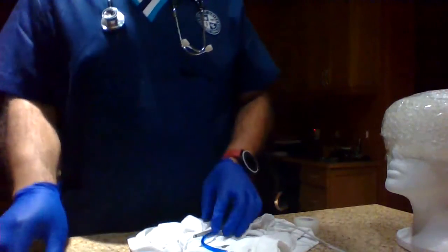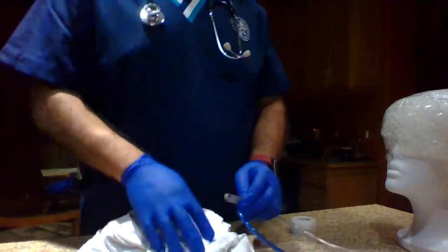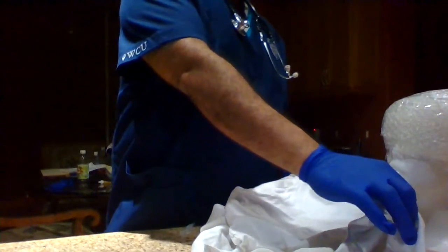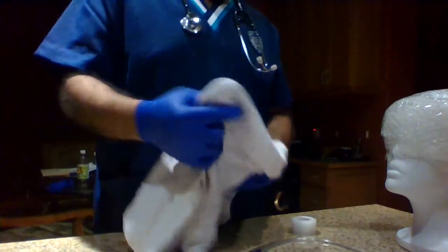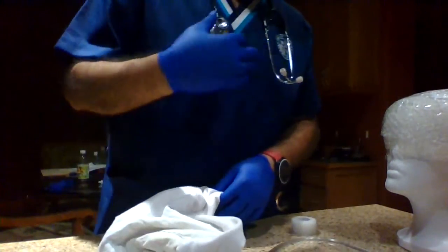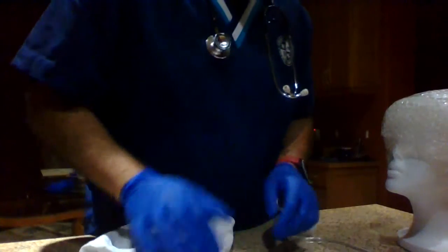So now you can start getting everything ready. And I did forget to say to gown the person in the beginning. I just caught that right now. Gown the person in the beginning before starting any of this, because there will be water that splashes all over.